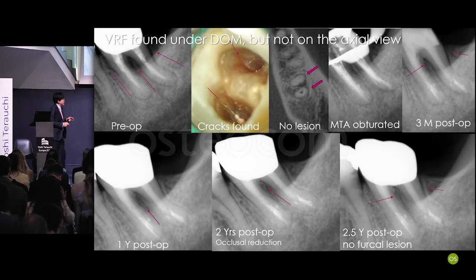But if you are not careful, if you have the habit, like a parafunctional, biting habit, you could have vertical root fracture in the end. So you have to be careful. Spend more time eating and drinking to reduce the stress. And that's what I told my patient. So first, I filled the canals with MTA. I put composite here and here in the coronal 1/3. And I reduce the occlusion every year. Every year I reduce the occlusion, just a little bit.